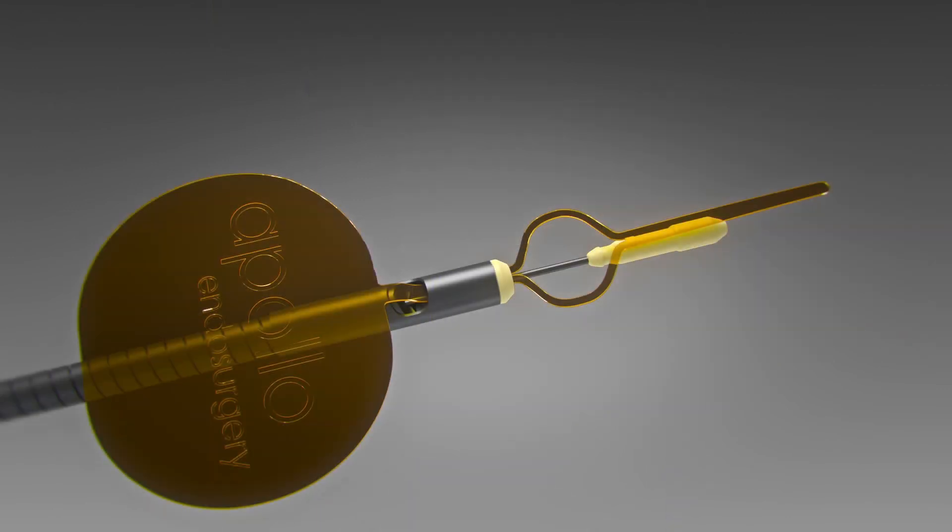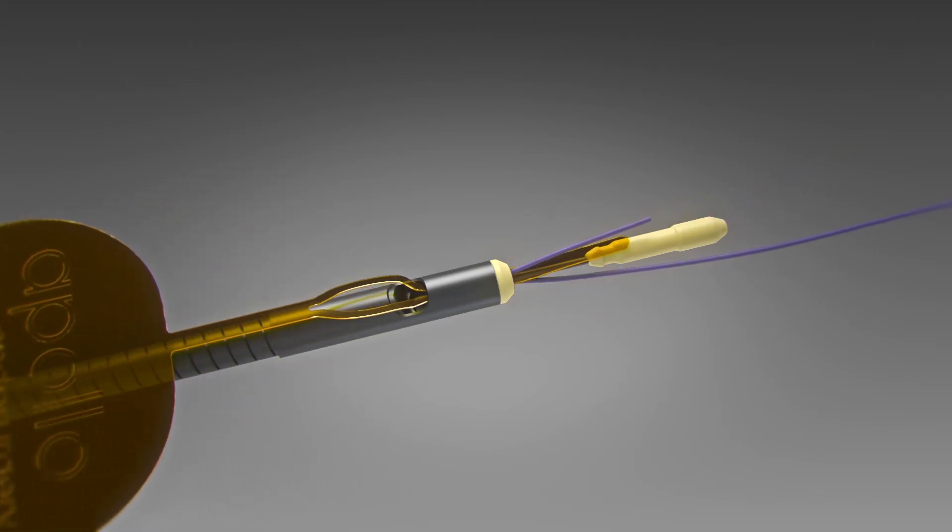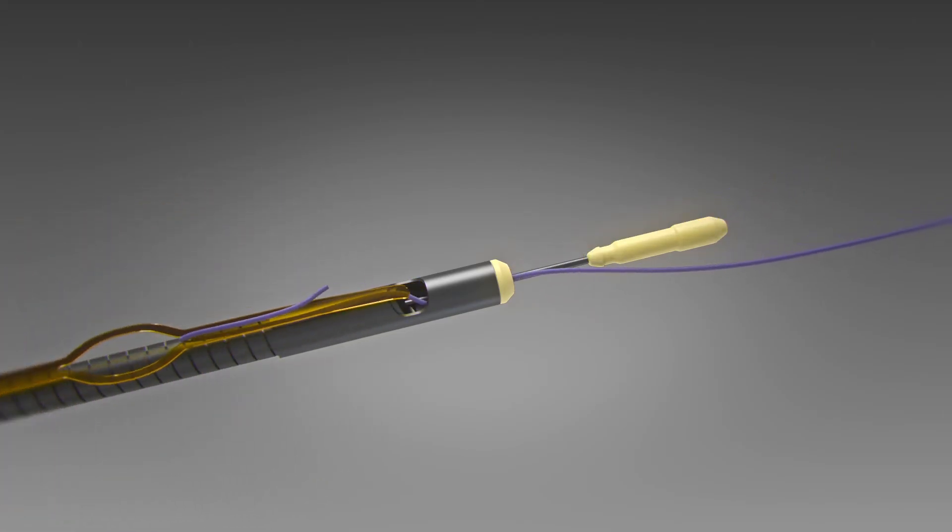To load the cinch, thread approximately 3 centimeters of the distal end of the suture through the gold suture loading loop. Pull the gold tab in line with the catheter until the suture has passed through the peak collar.